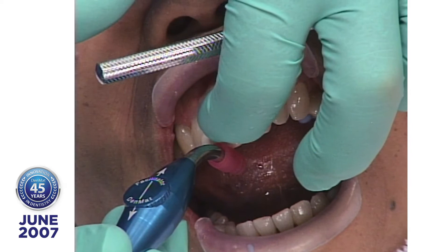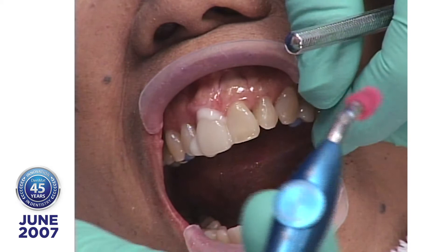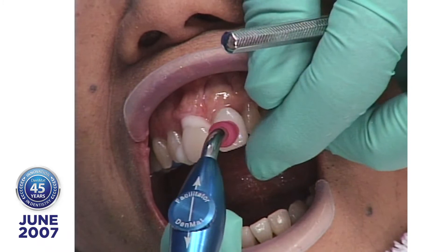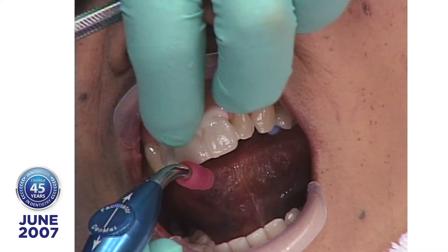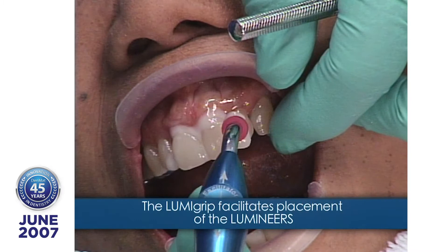In case you're wondering what this thing is I'm using here, it's called a LumiGrip. It's developed by Dr. Omer Meeker in Pasadena, California. It's a neat little suction device that enables you to carry the lumineer to the teeth. It always calls out the name of the tooth — not the number, but the name. This rubber plastic tip is soft.